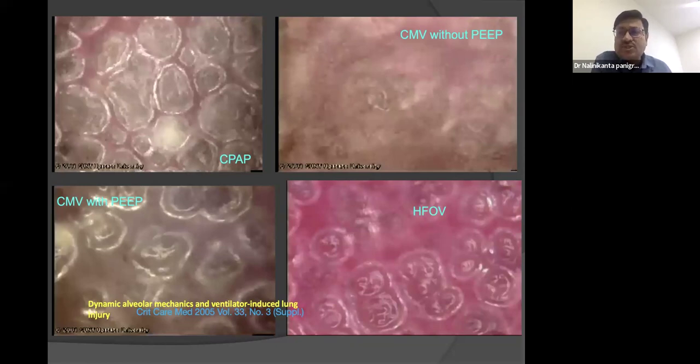Other two basic characteristics should be added to the supraphysiological rate. Those are, the ventilation should happen in a smaller tidal volume. If like conventional ventilation, 4 to 6, 7 ml per kg, we ventilate in HFO, it probably won't save the lungs, it will injure more.